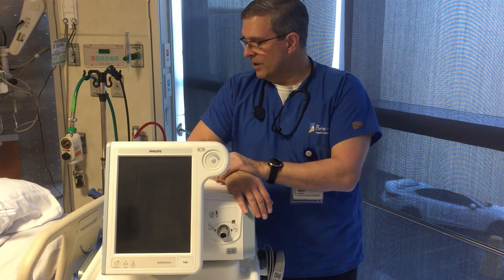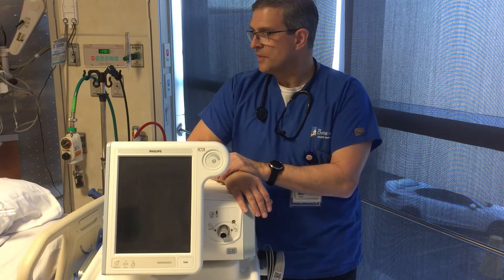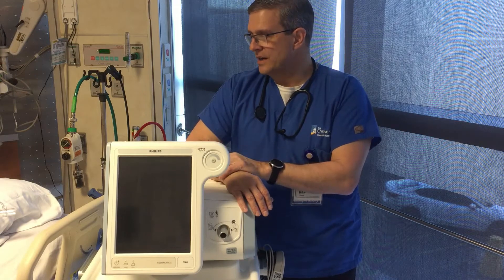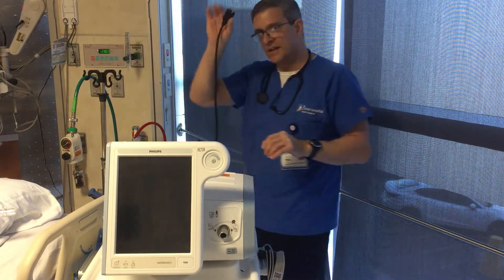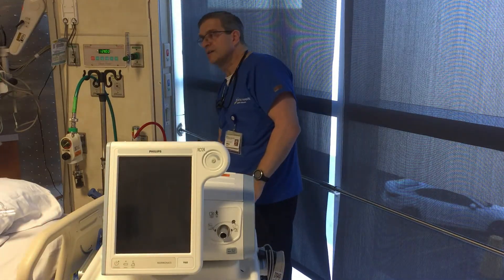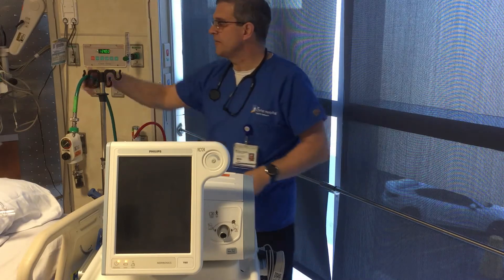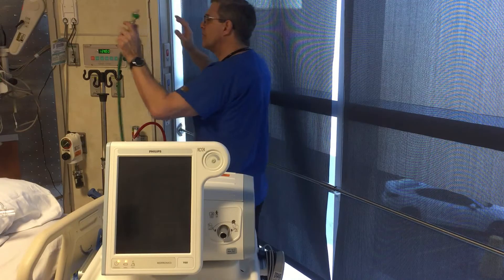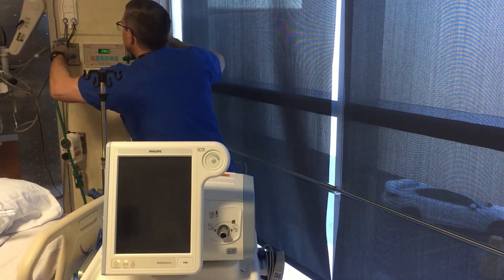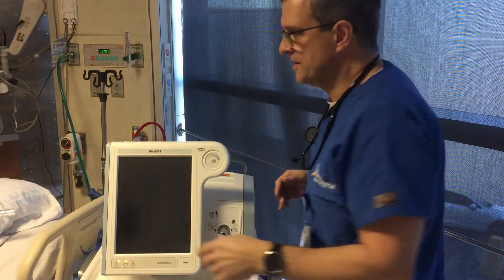This is one of the popular models we have here — it's a Philips V60, although there are a few different brands out there. Before we get started, we'll go ahead and hook up our power. It's electric power. We're going to plug it into a red plug so that it's on the backup generator in case the power goes out. We also need a 50 psi gas source, so we have our quick connect here — we'll plug that into the wall and then put our circuit together.